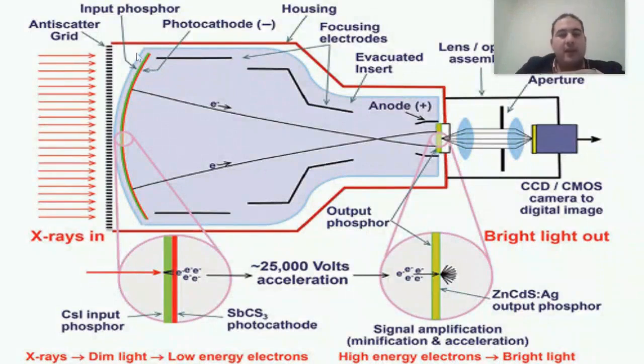It was mentioned that there is an X-ray photon entering here, and it does not follow the same path and sequence that I am following. It was also mentioned that there is an electron that gets scattered from my field and also travels to the output phosphor. Well, this will not just create an artifact.